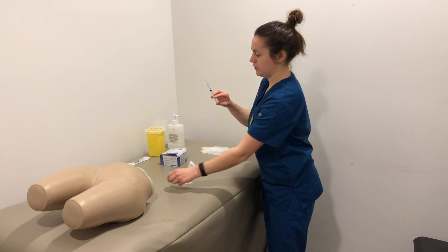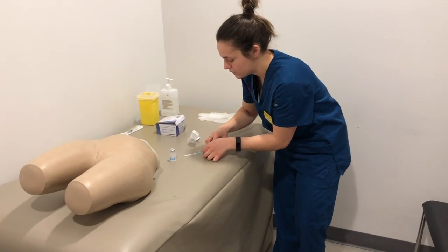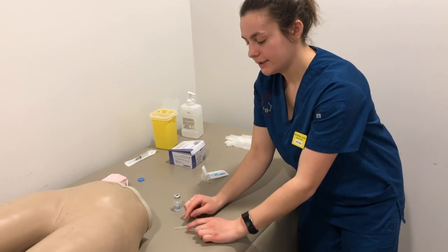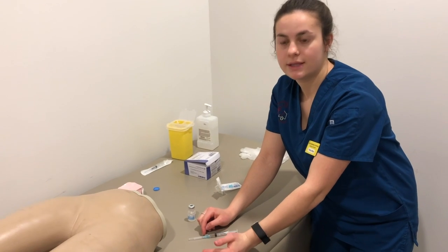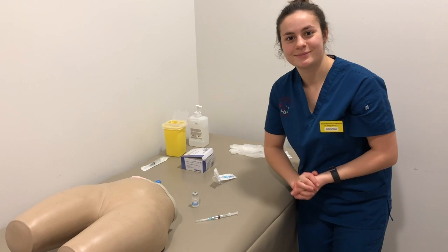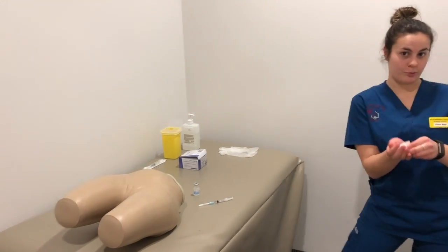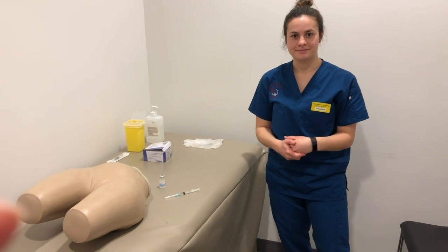Next I will be putting the sheath back on, using a one-hand technique to ensure that I do not end up poking myself. I will be applying the label to the disposable sheath with the patient's name, the dose, and the medication name, just to ensure that that doesn't get screwed up or confused. Now that the label is on and I'm all ready to go with that injection, I'm going to dispose of this in the appropriate receptacle. None of that is sharp, so that can just go into the garbage.